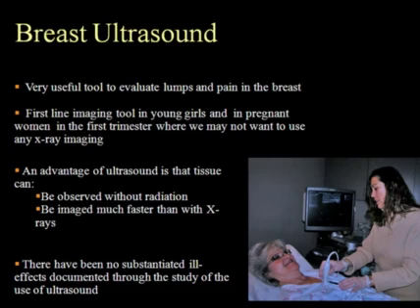Advantage of ultrasound in the tissue is that we can observe the tissue without radiation, and it can be imaged much faster than with X-rays. There have been no substantiated ill effects documented through the study of the use of ultrasound.